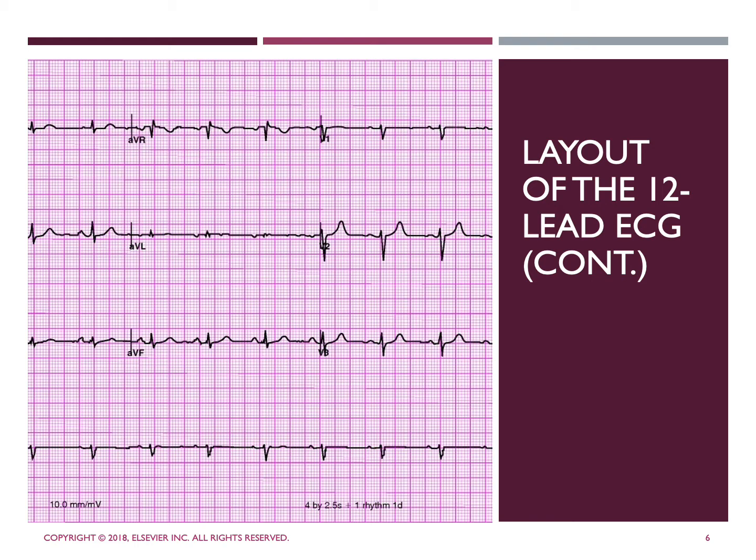Now the 12 lead ECG provides about a 2.5 second view of each lead, and basically that's done because it is assumed that 2.5 seconds is long enough to capture at least one representative complex. Although most 12 lead ECG machines obtain the signals for all leads at the same time, other machines obtain the signals sequentially. So, for example, all limb leads, then the augmented limb leads, followed by leads V1 through V3, and then finally leads V4 through V6.